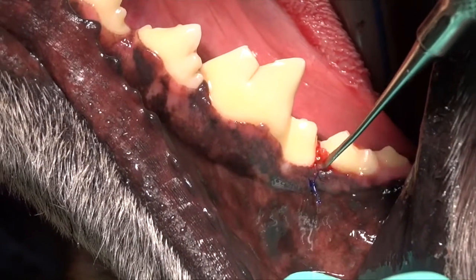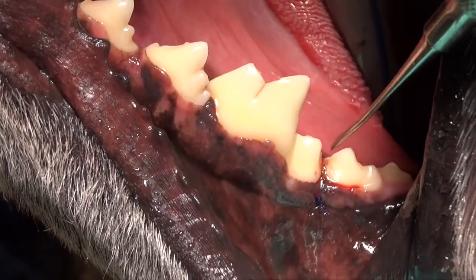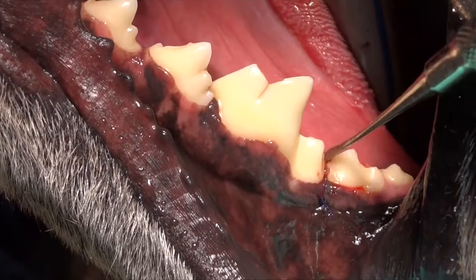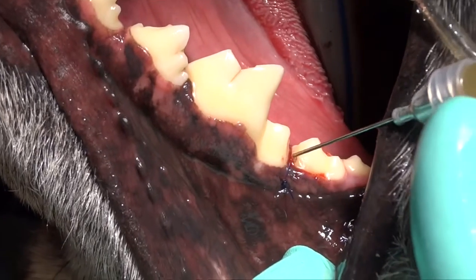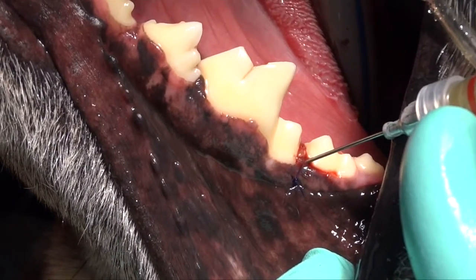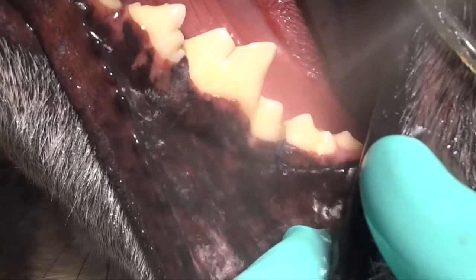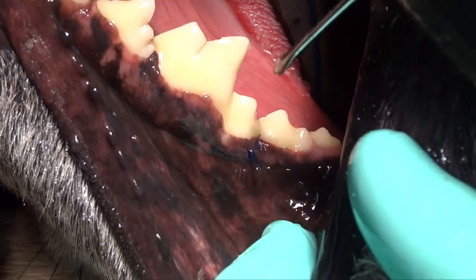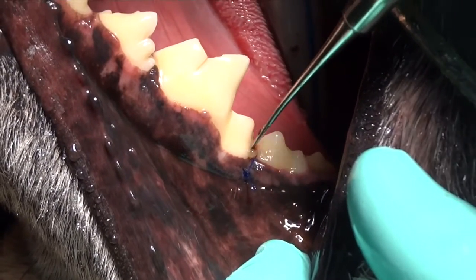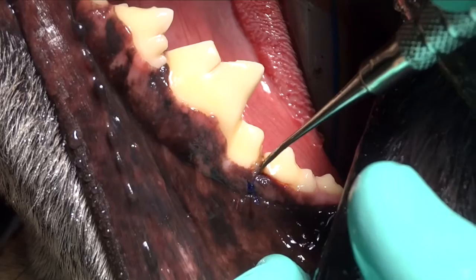You can also create a membrane on a glass slab using Doxyrobe, solidify it, and then place it in the open defect before you suture. You may want to do that for larger defects. For a small defect like this, this is a very simple technique using a product you should already have in your practice if you're doing dentistry — one we use in gingival pockets to decrease pocket depth and increase periodontal attachment. Here we're using the periosteal elevator to place that down on top of the bone graft and seal it so none of the bone graft leaves the site.